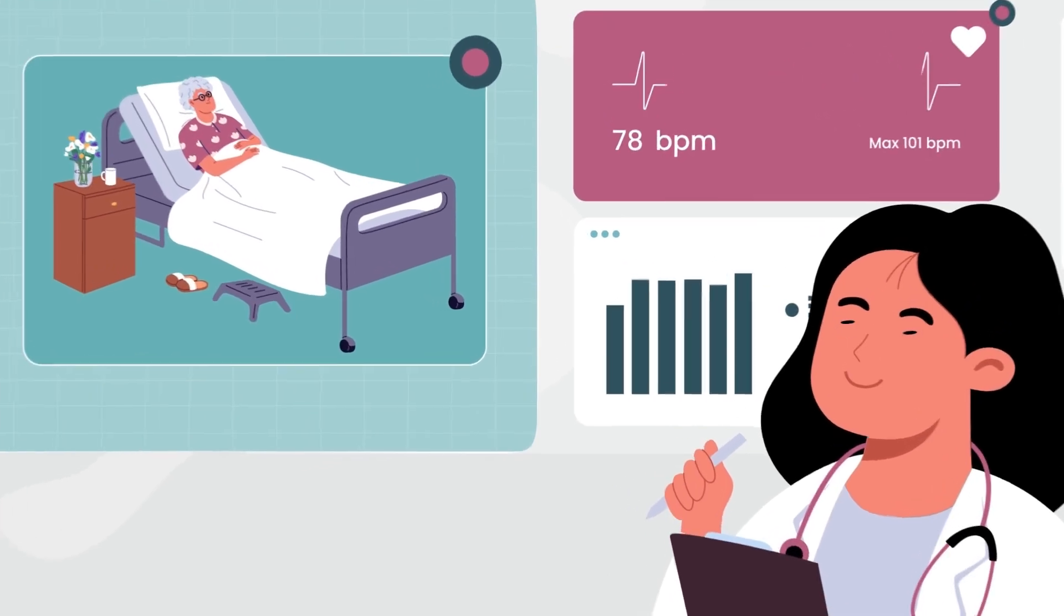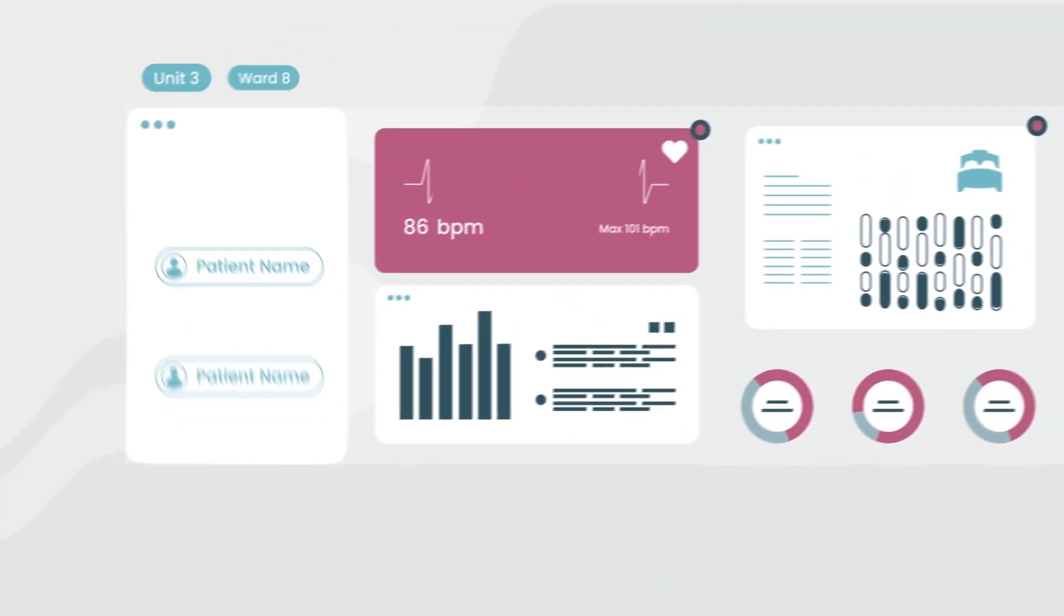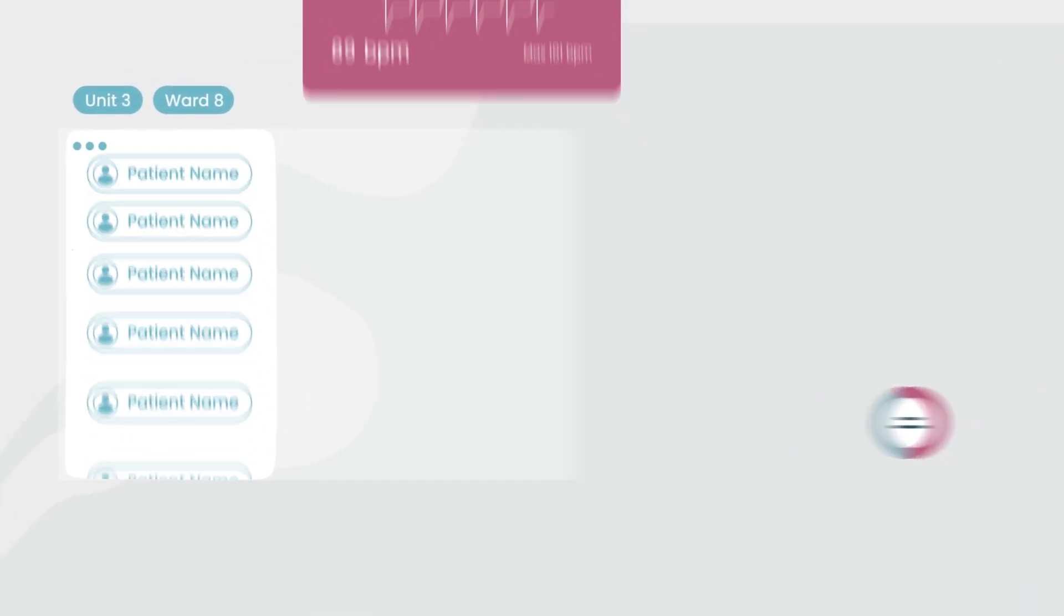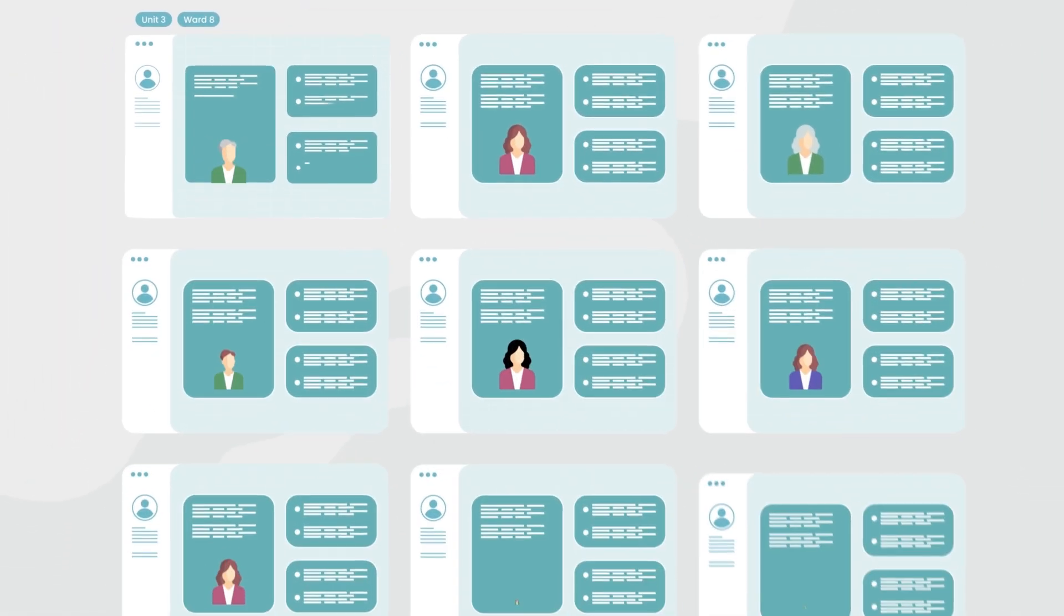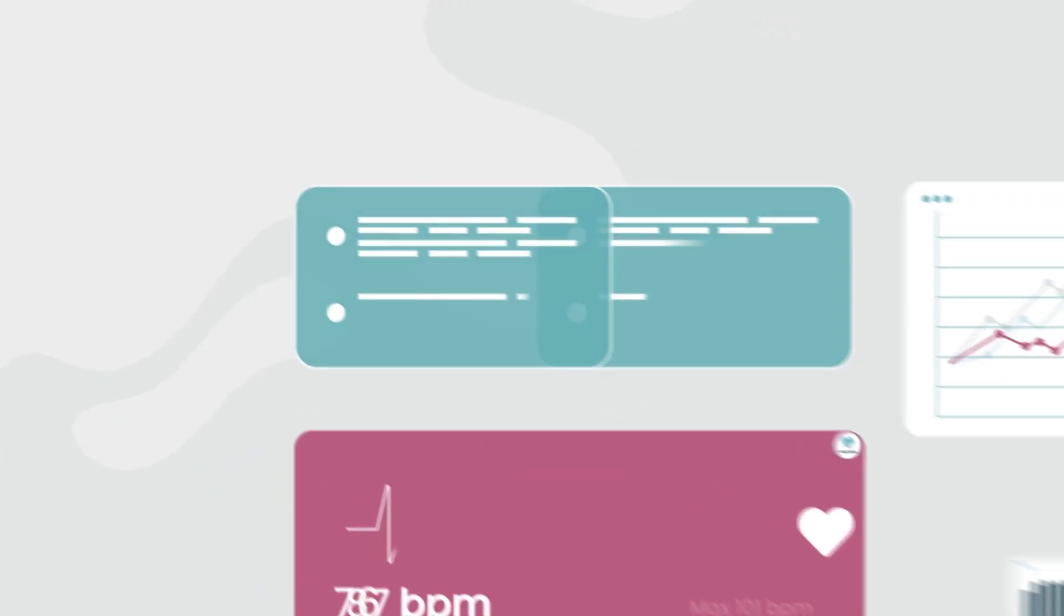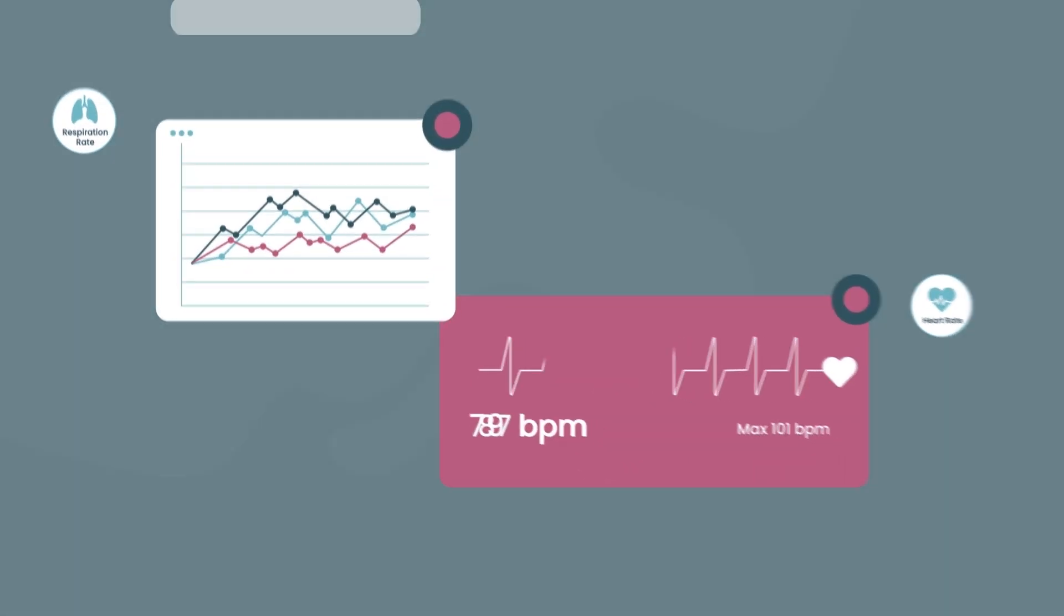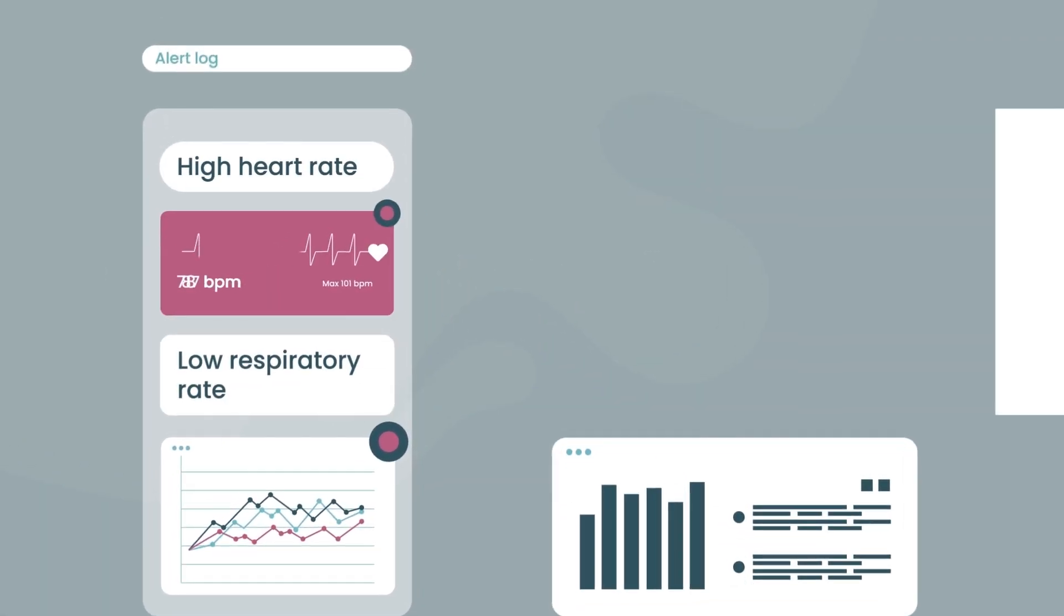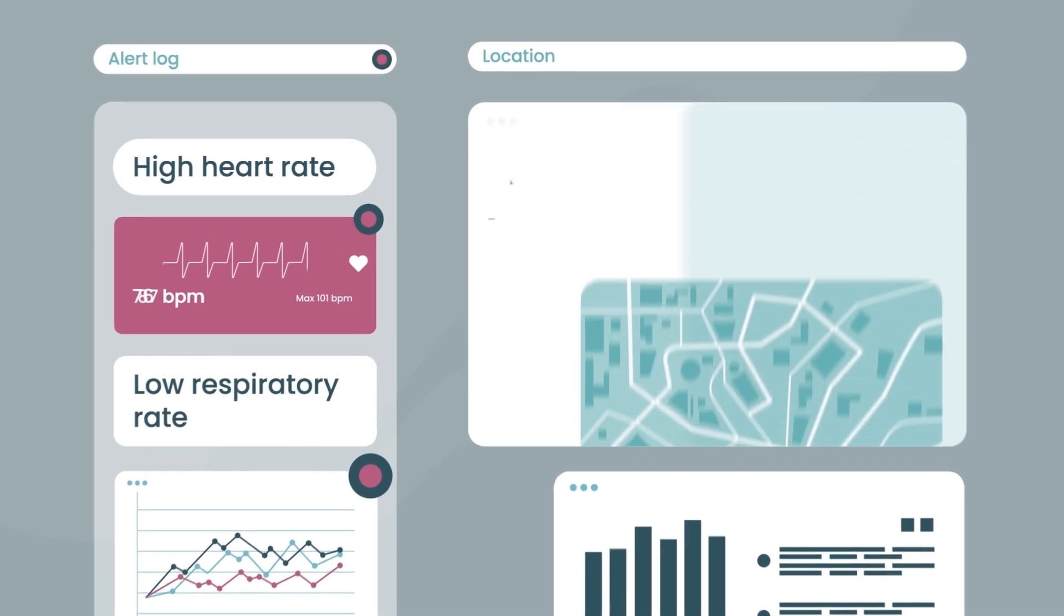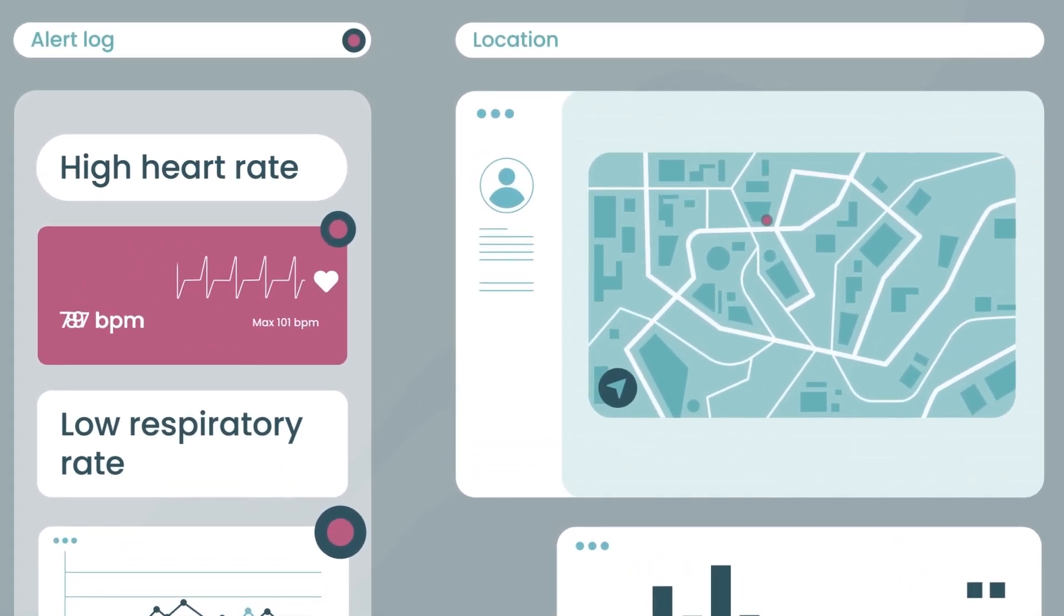The nurse's station allows you to view all patients in the unit or ward, their room and bed number. Their heart rate and respiratory rate are displayed in real time. Patient alerts are indicated in red and an alert log aggregates types of alerts and patient location.